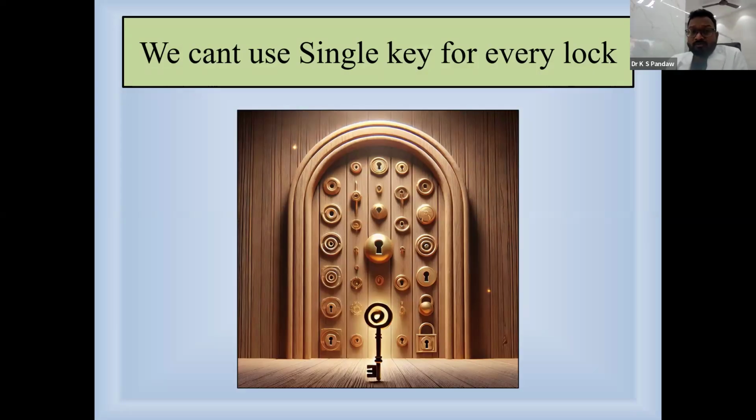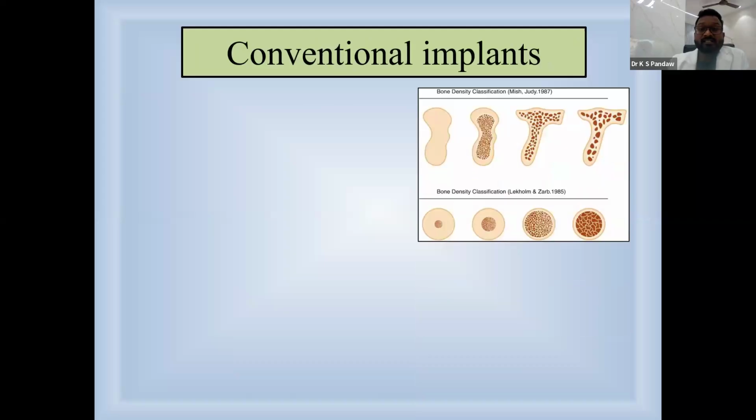The problem is that we are trying to open all the locks with a single key. If I am using conventional implants, I want to place conventional implants in all cases. If I am a basal implantologist, I try to put basal implants in all patients. So let's see where to use which implant, how to choose the implant system according to the patient. We have to make a tailor-made treatment plan for the patient.